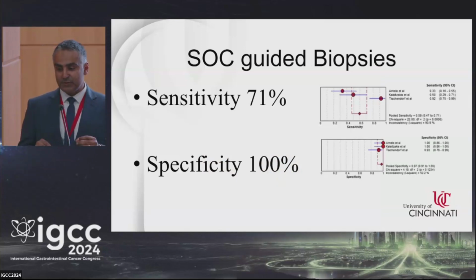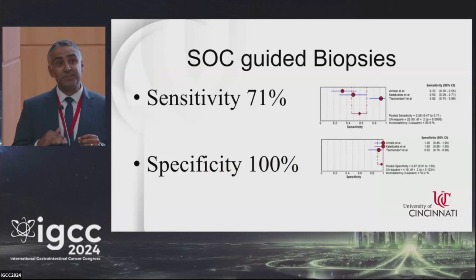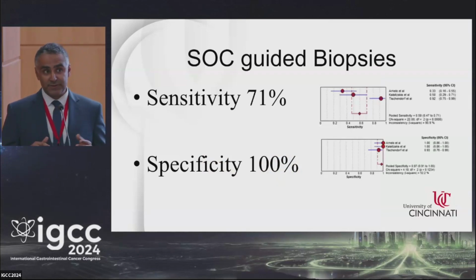Cholangioscopy-guided biopsies will increase the sensitivity to above 70% with a specificity of 100%. So it's a good improvement when we compare it back to just brush cytology.